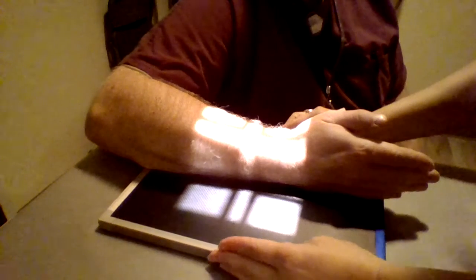Let's get them nice and centered. Collimate it in. Just make sure everything's all nice and straight. You're going to be using a 10 by 12 cassette IR, 64 kVp at 4 mAs.